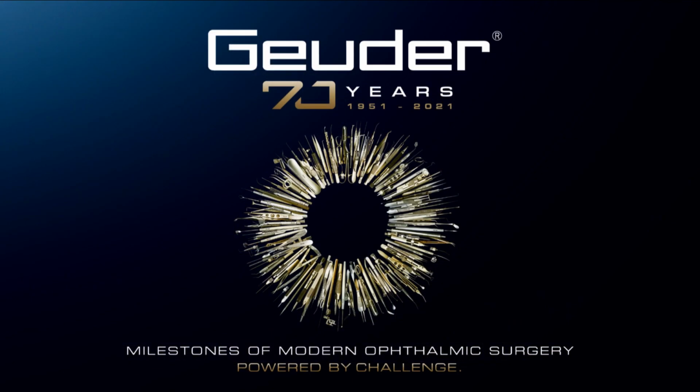This brings us to the end of the instructional video, in which you were given an overview of the necessary device systems and corresponding accessories. We provide further information regarding parameterization or interventions in the anterior segment in other application videos.